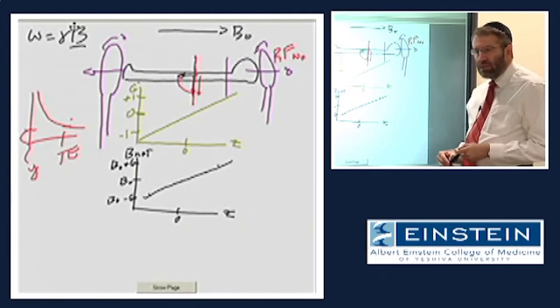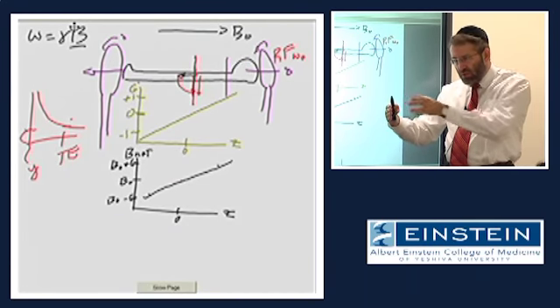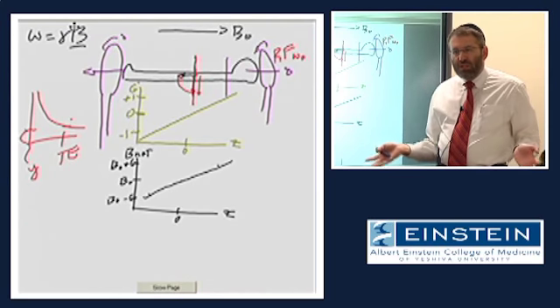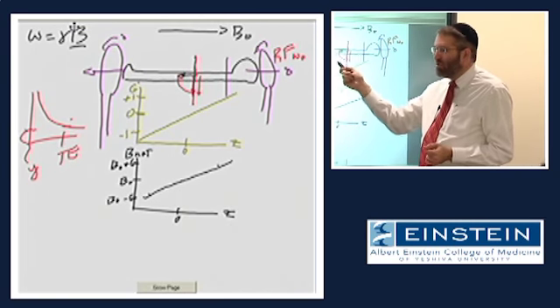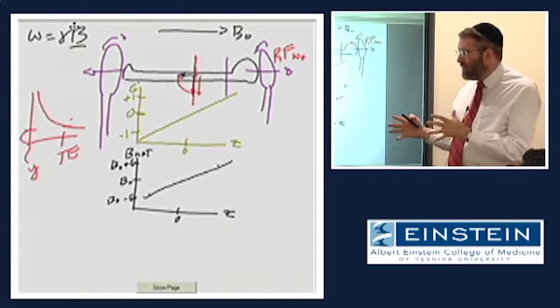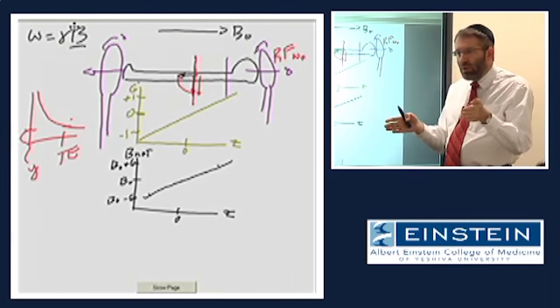That's generally not what happens, right? Unlike CT, where if you ever go and observe a patient having a CAT scan, they lie on the table, and the table moves through the CT gantry as they essentially get sliced up like a bread slicer. In MR, you put them on the bed, it slides into place, and all the imaging takes place without the patient ever moving. Now, if you're talking about imaging the abdomen or the chest or the head, large discrepancies in territory, I think Victoria asked about this yesterday, you would move the table to get the basic body part in position. But in terms of multiple slices within a certain anatomical region, we do all that imaging without moving the patient.